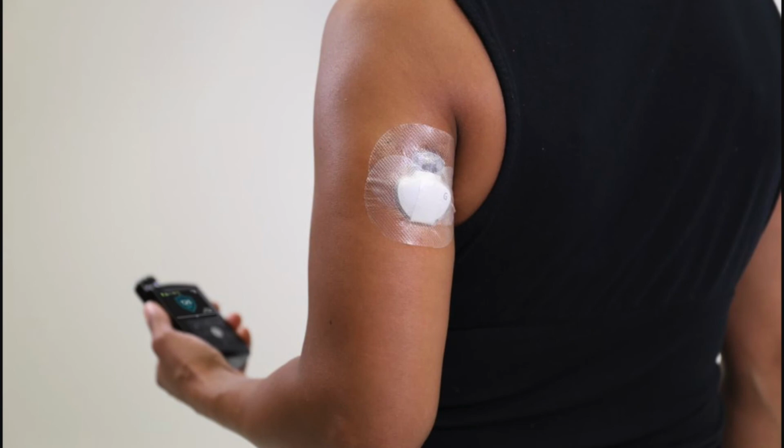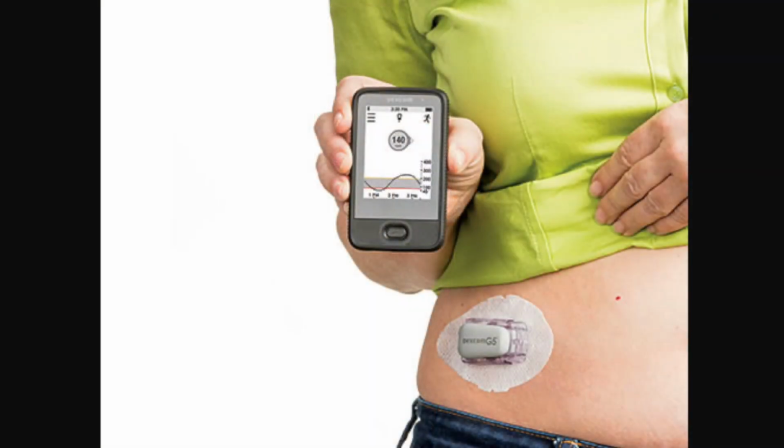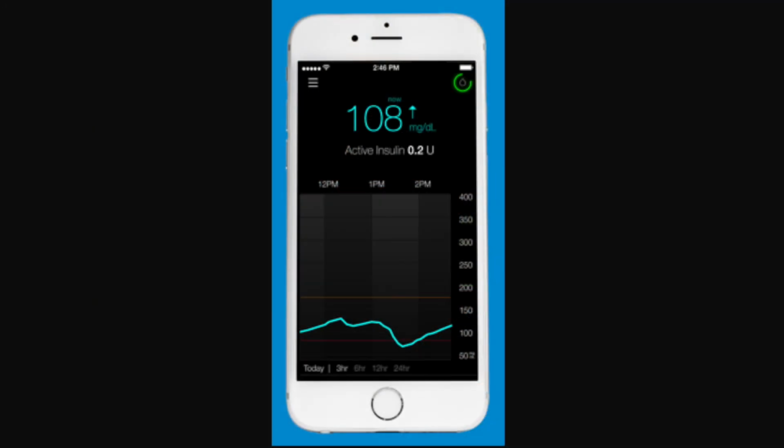Now, something else you're going to see is an insulin pump that's going to be used in conjunction with a continuous glucose monitor. And what a continuous glucose monitor is something that a patient, again, inserts underneath the skin. It's a subcutaneous sensor that they change about once every 1 to 2 weeks. And those are going to give real-time blood sugar values to give real-time data to direct insulin delivery.